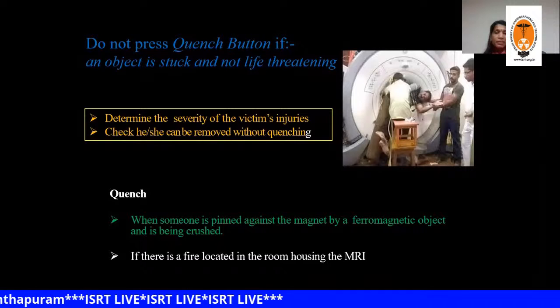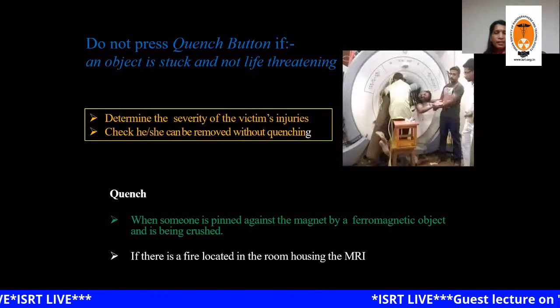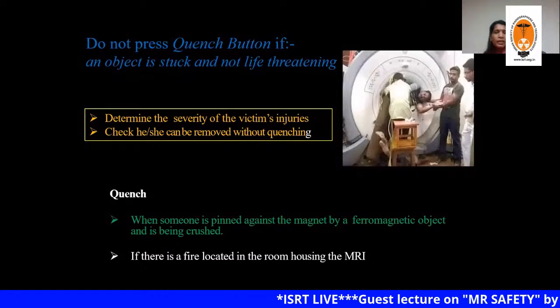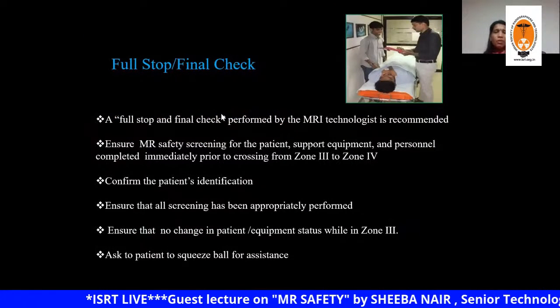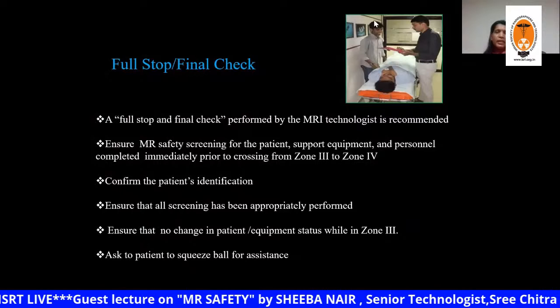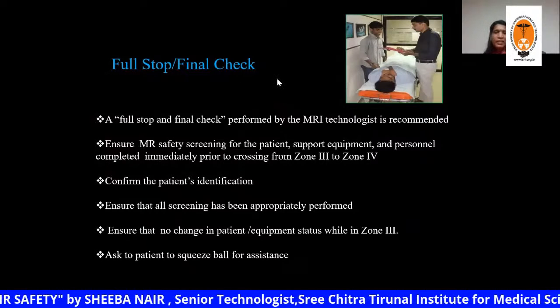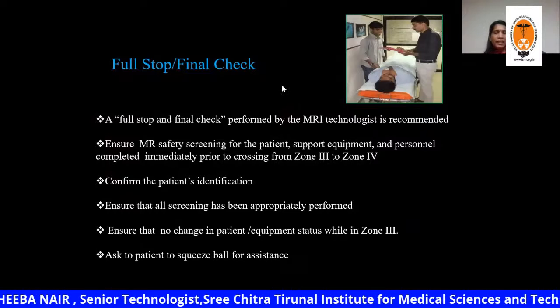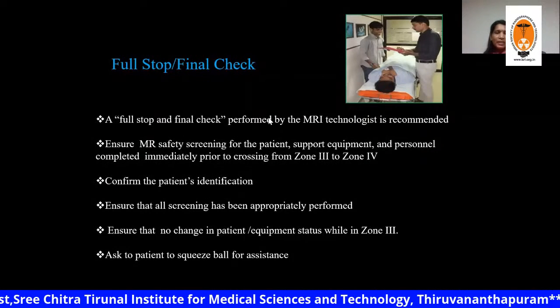And also, if there is a severe fire in the MR scanner room, then it is recommended to quench the MRI. So, coming to the conclusion, the most important step in MR safety is the full stop, or the final check that we make at the last, just before taking the patient.